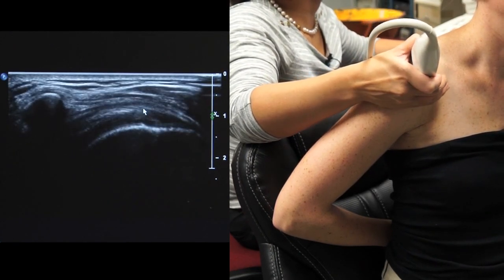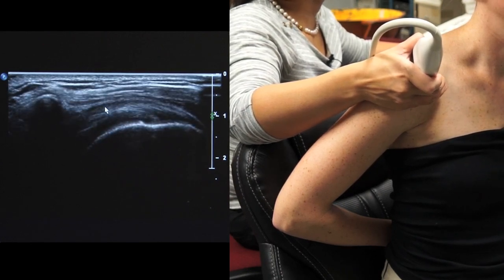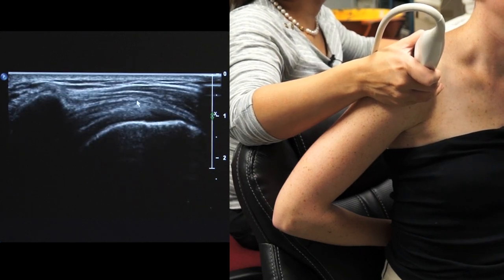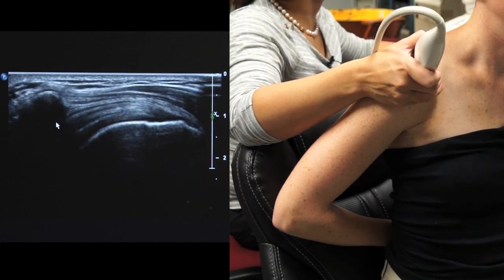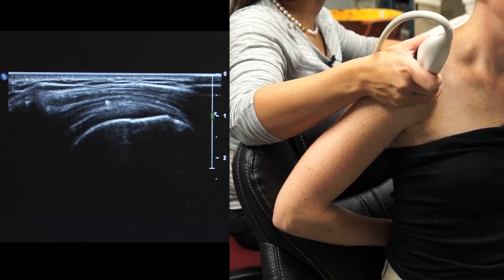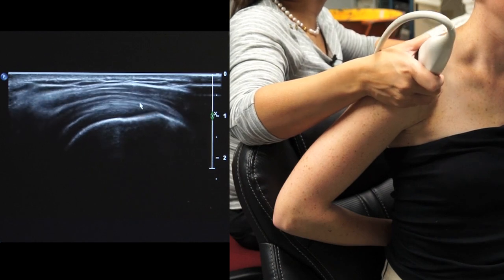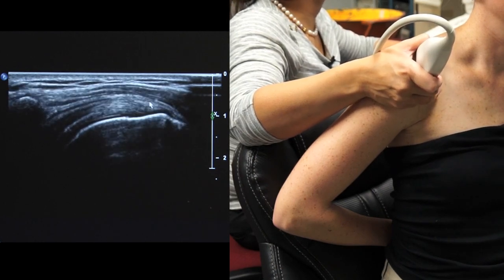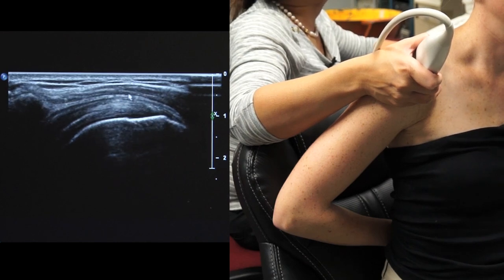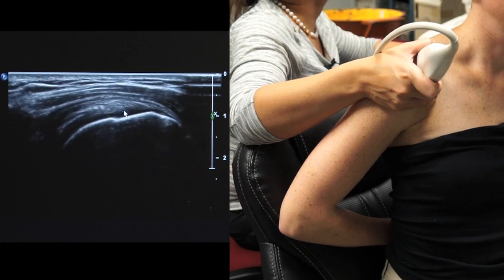the acromion process. Okay. Now another thing to note is that the subacromial subdeltoid bursa, which is subdeltoid underneath the deltoid, underneath the acromion, is a potential space that sits right here, just superficial to the supraspinatus tendon. So when there is no pathology, we will not see this bursa, but as you can imagine, when it is distended with fluid, we will see a hypo to anechoic structure in between the deltoid and the supraspinatus tendon.